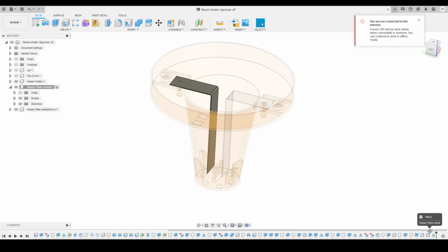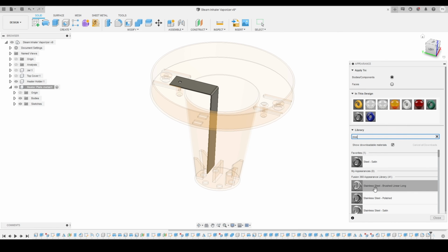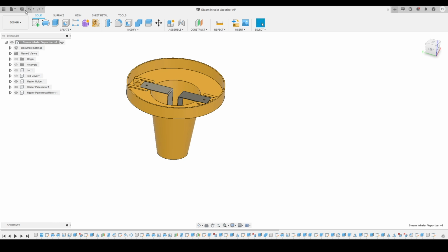And now I will go into the modify panel. We'll go into the appearance tab, and now I'm going to apply some metal appearance on this heater plate. So I will just search for a metal material, maybe steel or something like that, and then we'll drag that particular material onto our component. Here you can see the appearance has been changed a little bit. So if I turn on the top level assembly, here you can see, the things will look something like this: heater holder and the two metal plates.